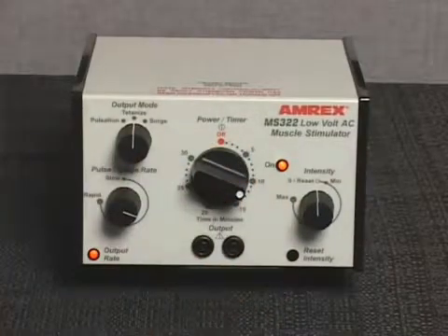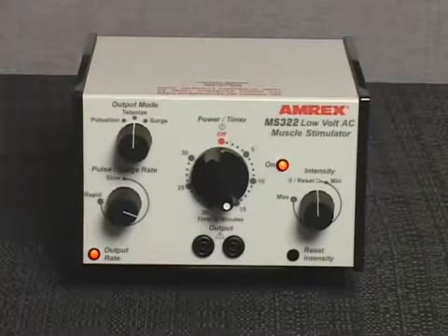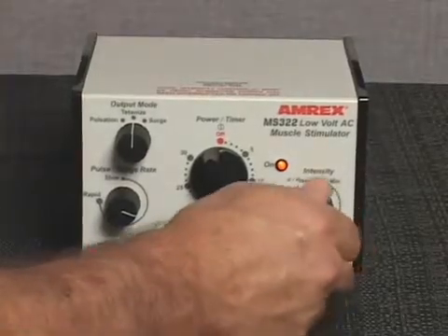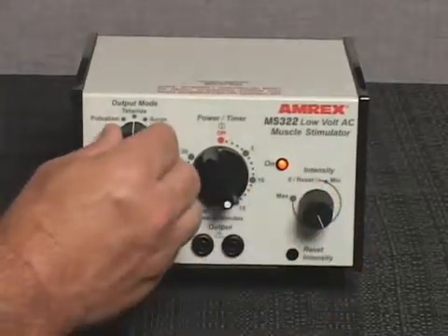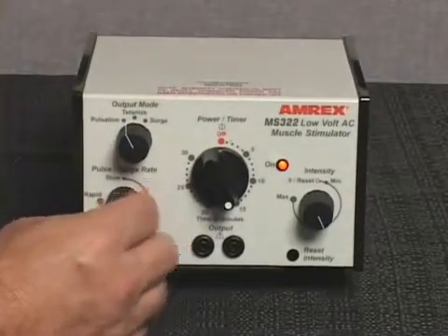Rotate the power timer knob and set it to the desired treatment duration. The stimulator on indicator light will illuminate. Slowly increase the stimulator intensity control to the desired output level.